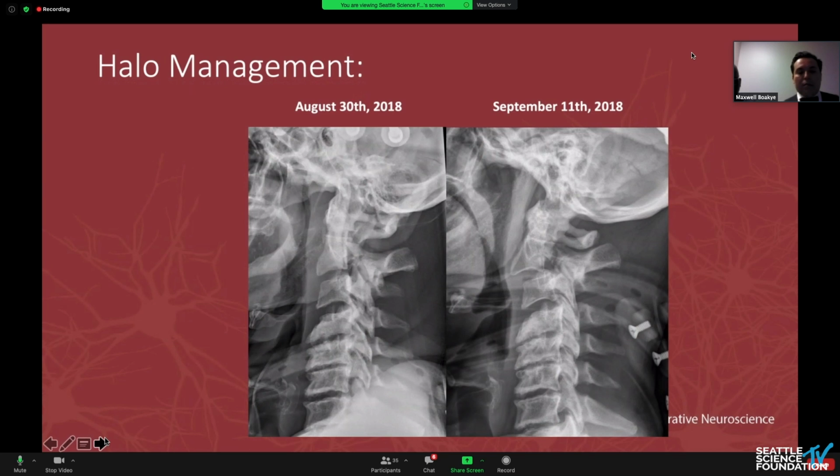The only thing is, I've sort of gone on these cases now, I like to go anterior because you can put in large allografts, you can put an anterior plate on, and you don't have to go posteriorly. And I think going to the occiput on this case probably didn't necessarily fix the alignment.